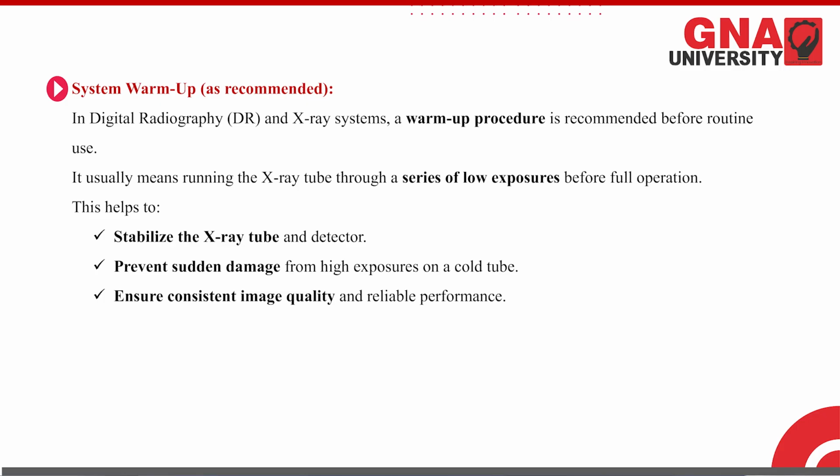In digital radiography systems, DR systems, and X-ray systems, it can be a CR system, it can be a mammography system, a warm up procedure is recommended before routine use. That is, it is necessary to go for a warm up, and it usually means running the machine. What is the warm up? Simply we can call it running the machine through a series of low exposures before full operation.